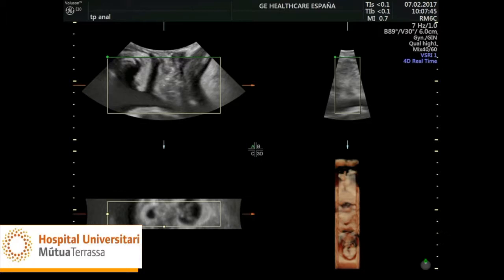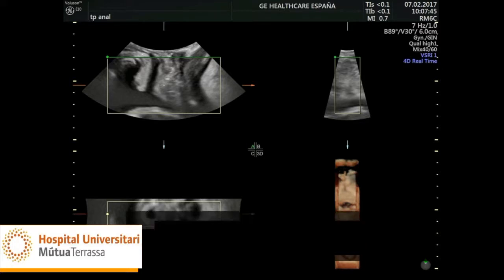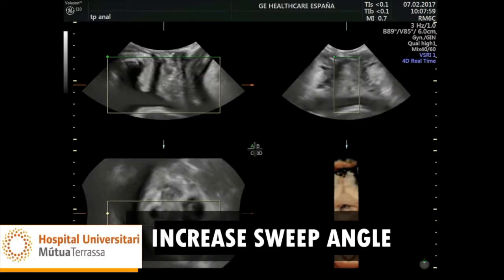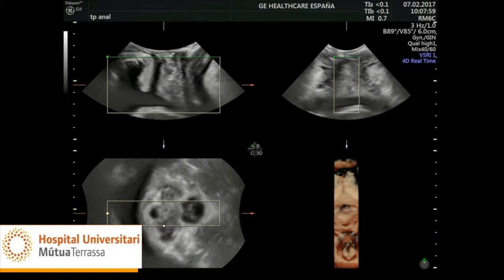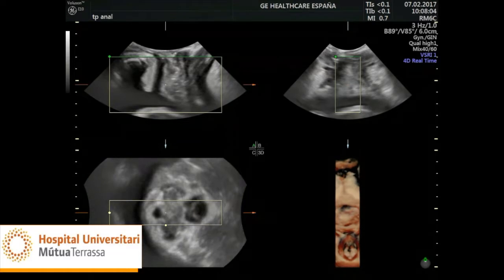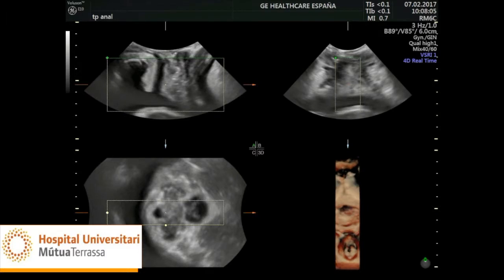Once these parameters have been assessed on two-dimensional ultrasound, we move on to activate the dynamic three-dimensional ultrasound or 4D ultrasound. The sweep angle should be increased to its maximum to ensure the entire urogenital hiatus is included. When this is done, we get four images: the left upper image shows the sagittal plane (plane A), the right upper image shows the transverse plane (plane B), the left lower image shows the axial plane (plane C), and the right lower image is the rendered three-dimensional image.